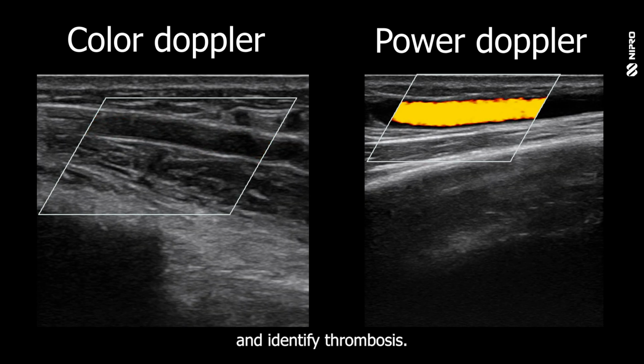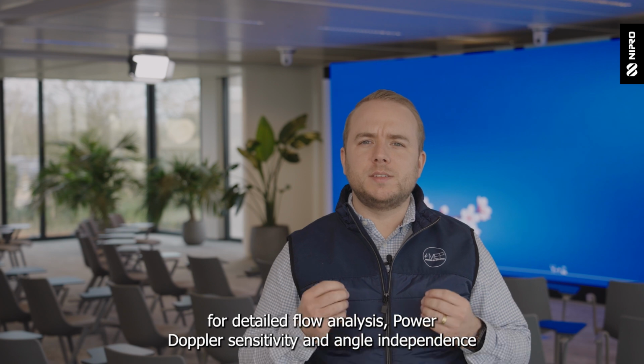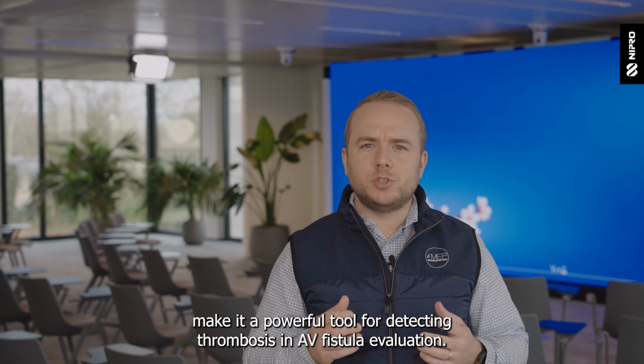and identify thrombosis. To sum up, while color Doppler is excellent for detailed flow analysis, power Doppler's sensitivity and angle independence make it a powerful tool for detecting thrombosis in AV fistula evaluation.